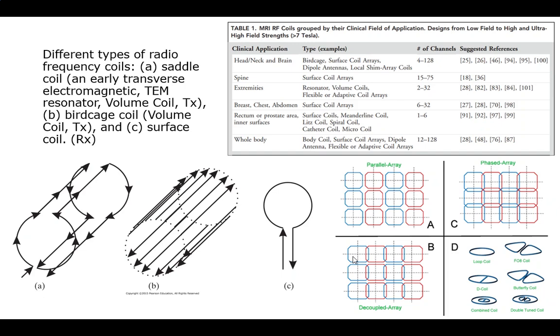Next I'll talk about the coils, because we need them. They've already come up a couple times here.